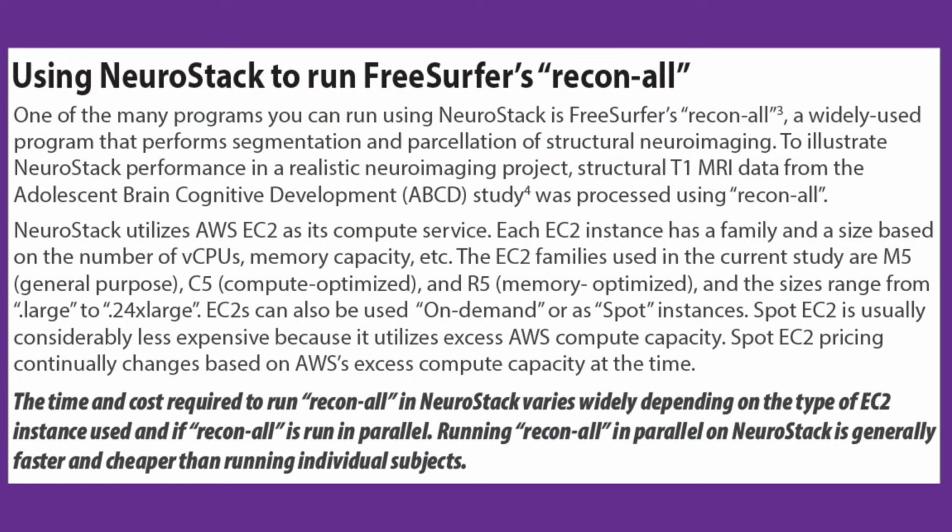NeuroStack can run a wide variety of neuroimaging programs. One such program is FreeSurfer's recon-all, a widely used program that performs segmentation and parcellation of structural neuroimaging data. To demonstrate the cost and time involved in running a realistic neuroimaging project using NeuroStack, we processed structural T1 MRI data from the ABCD study using recon-all.